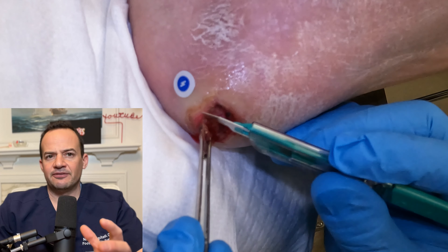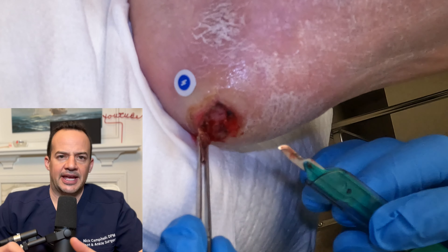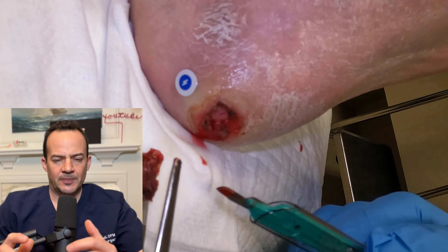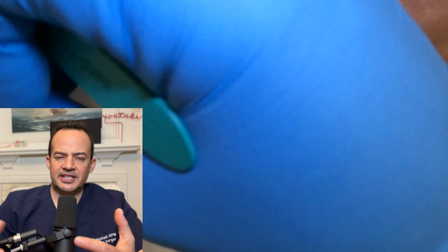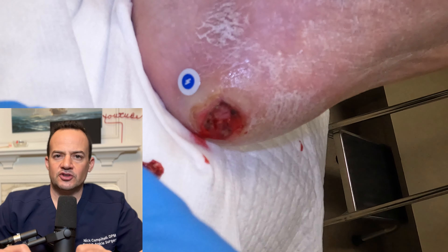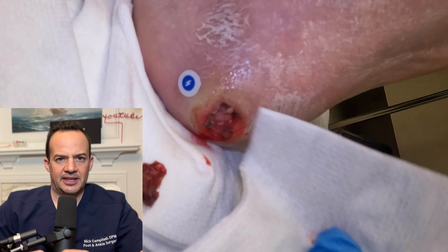The patient can't feel this because they have neuropathy. Neuropathy is very common in diabetic patients — it's when the nerves don't work as well. They lose protective sensation; they can't feel pain, light touch, or sharp-dull sensations, so they're not actually feeling anything I'm doing.